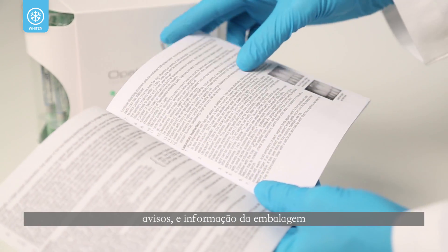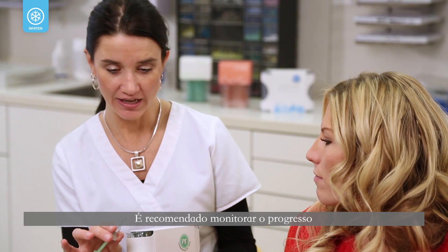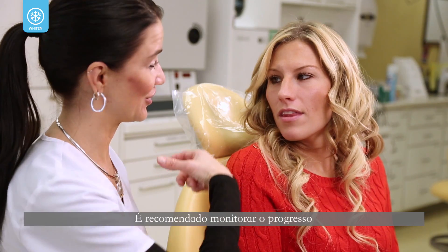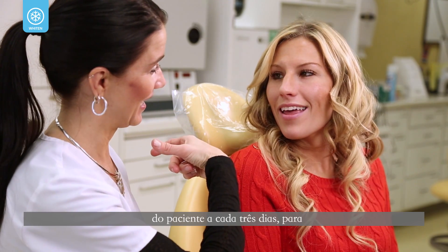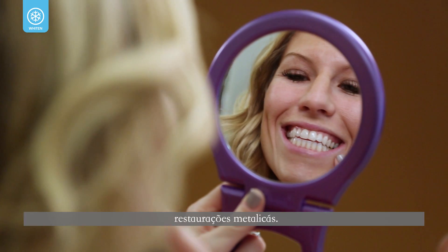Be certain to read the product instructions, warnings, and information contained in the package, and advise the patient accordingly. It is recommended to monitor the patient's progress every three days to avoid translucency or discoloration around metallic fillings.